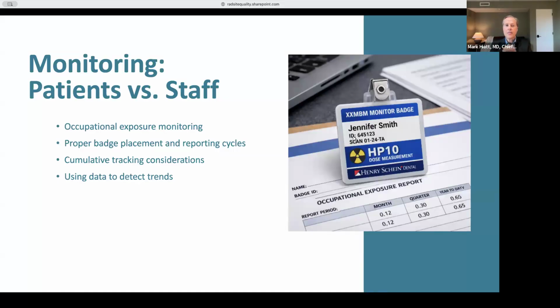And Chris, can you comment on this dichotomy and perhaps the different approaches to monitoring those two different classes of people? Yeah, so I think of it this way. Staff monitoring is basically worker safety plus compliance. The first question is, are employees staying well below the limits? So review your dose reports and see if they're below the limits.